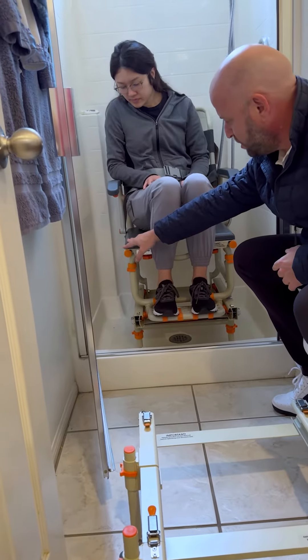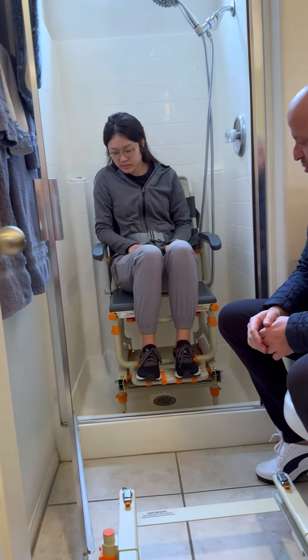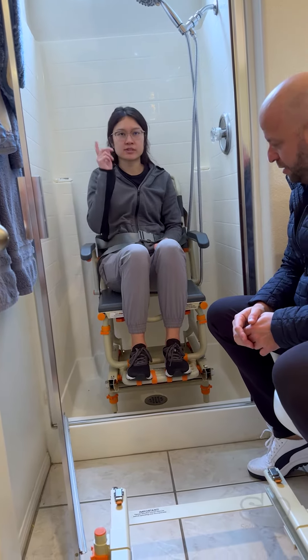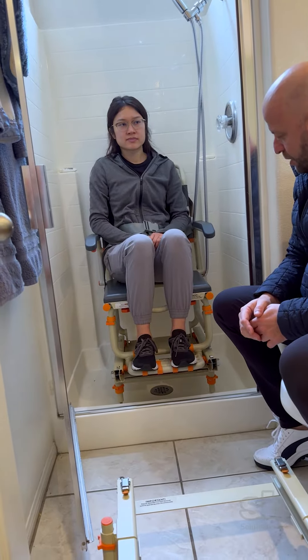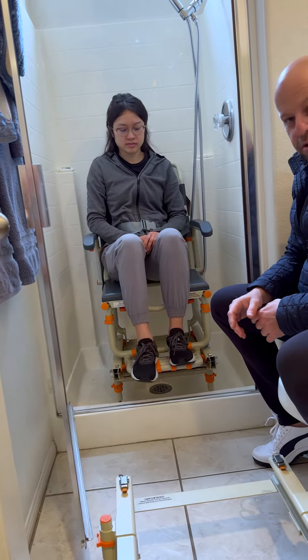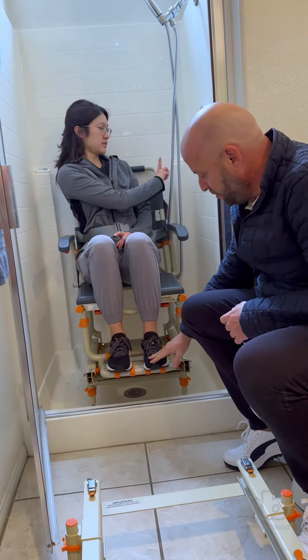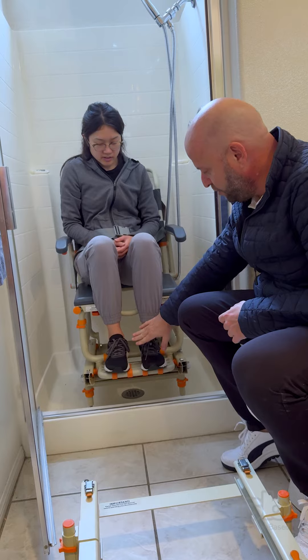We'll also adjust the seat higher up so she can do a pivot transfer from her bed or wherever. We'll also be able to go another four inches back because of the back angle. If we get a straight back, her feet will be able to go further in.